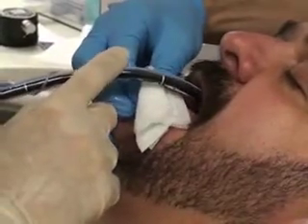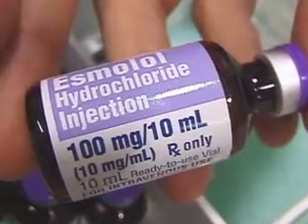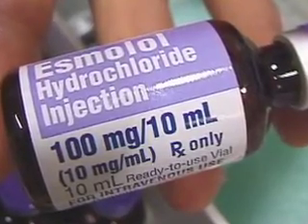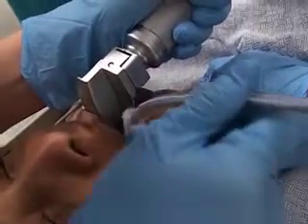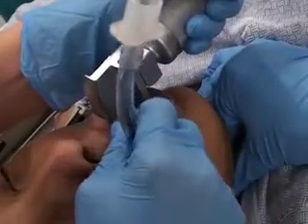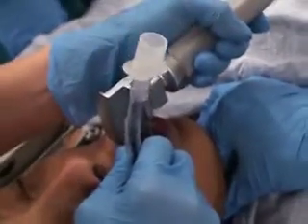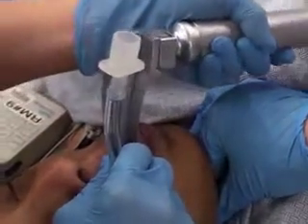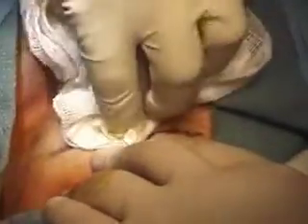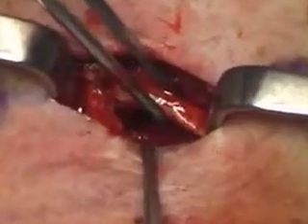Manipulation of the airway is usually noxious for patients, causing increased myocardial demand. Pre-treatment with opioids or beta blockers can reduce this catecholamine-mediated stress. If the medical indications that led to intubation have not been adequately resolved, progressive decompensation may occur after extubation, ultimately leading to reintubation. A tracheostomy is generally indicated if safe extubation cannot be achieved in 7 to 14 days.